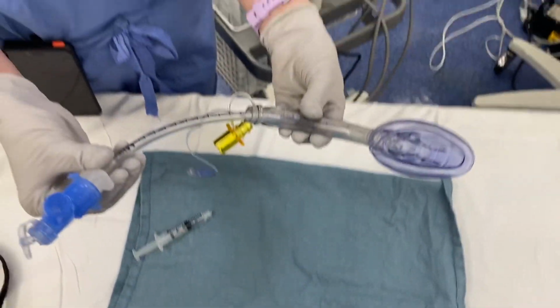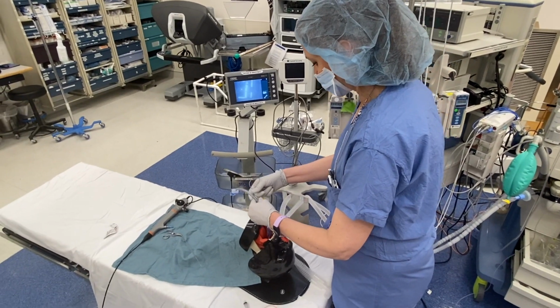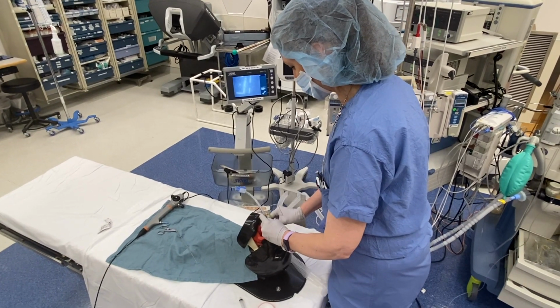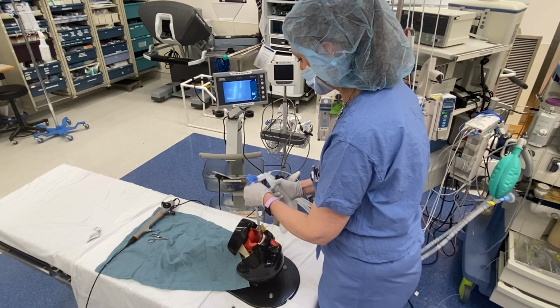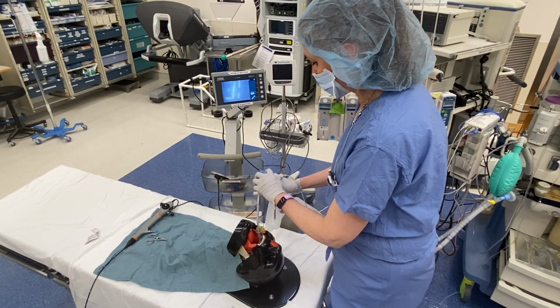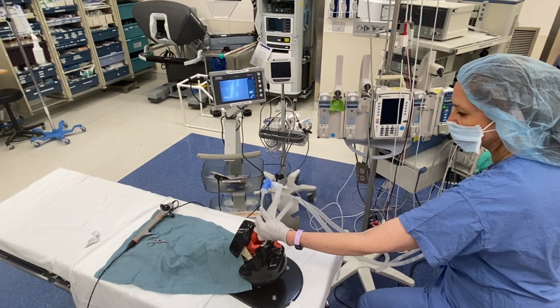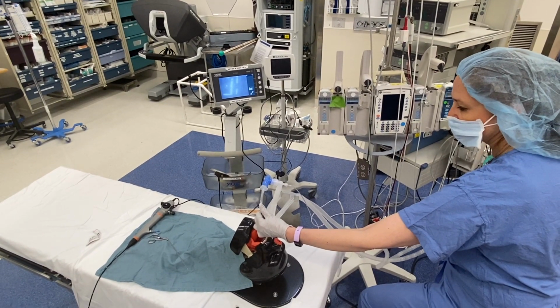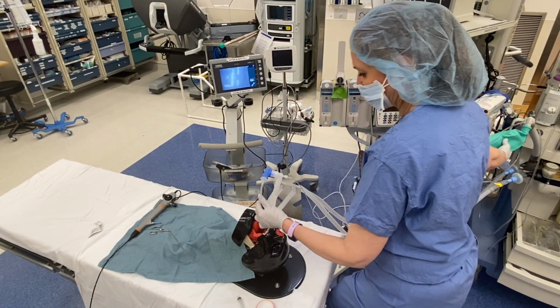Now this is our supraglottic airway device. So here Bistra has the hybrid LMA and ET tube setup that we showed you earlier, and we're going to demonstrate how to intubate through the laryngeal mask airway whilst continually oxygenating and ventilating. So she has placed the ET tube LMA hybrid and is testing to make sure we can ventilate, and as you can see, we can ventilate.